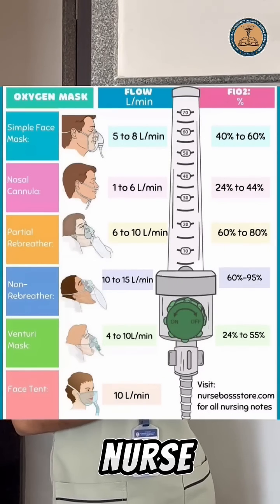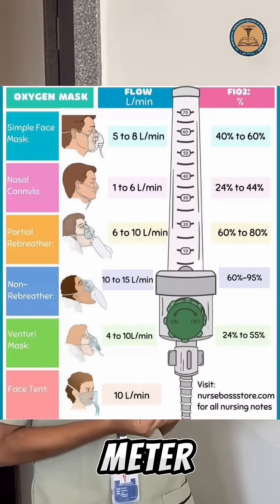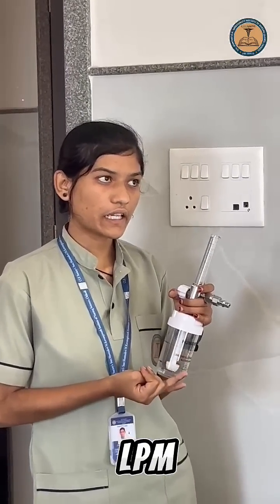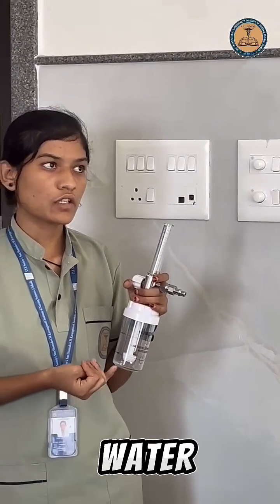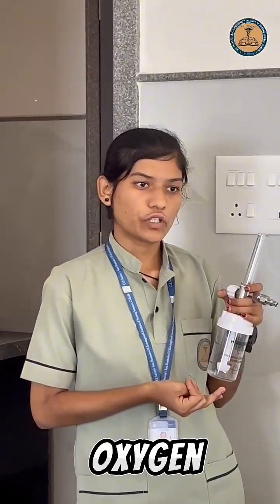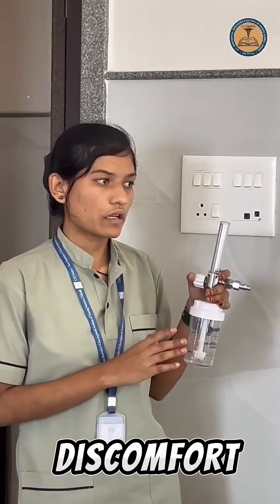Role of nurse. As nurses, we must check the oxygen source and flow meter. Set correct LPM as prescribed. Ensure humidifier has clean distilled water. Monitor the patient's oxygen saturation using a pulse oximeter. Observe for signs of oxygen toxicity or discomfort.